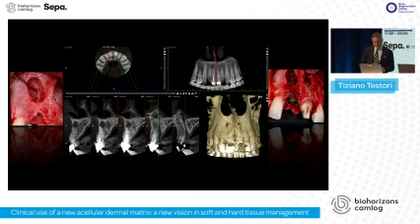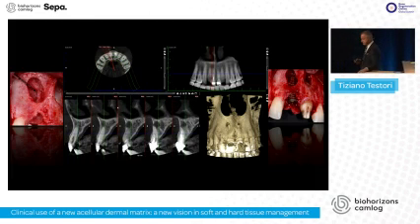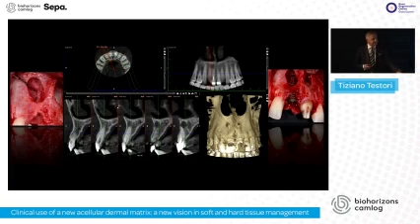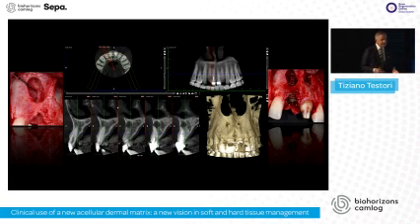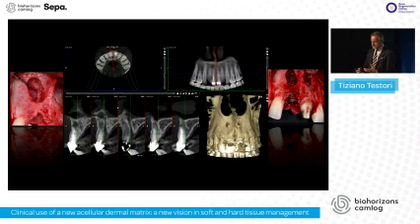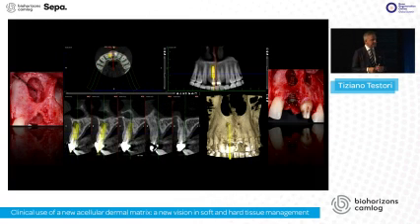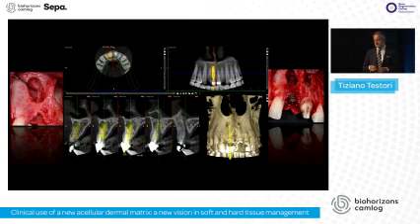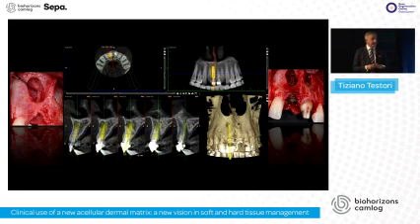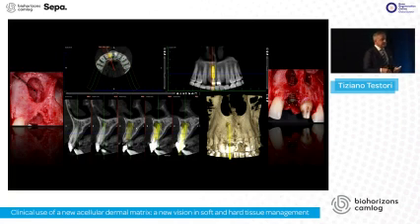And as you can see from this video, we have some bone deficiency, and at the same time we want to reconstruct the hard tissue, and we want to achieve the goal of soft tissue management that nowadays is as important as the bone regeneration that for many, many years we focused on.